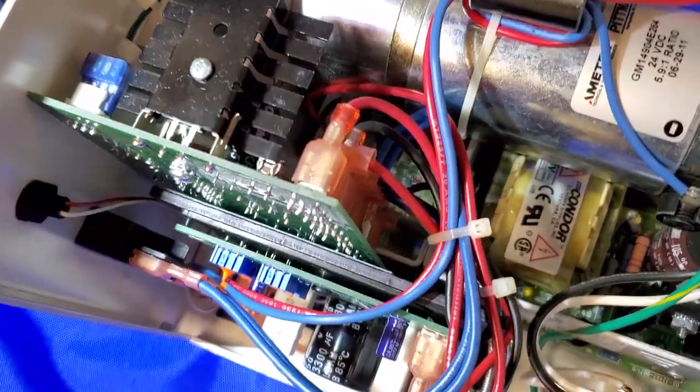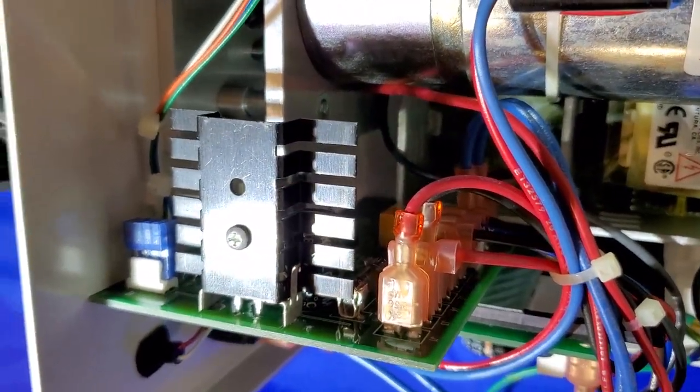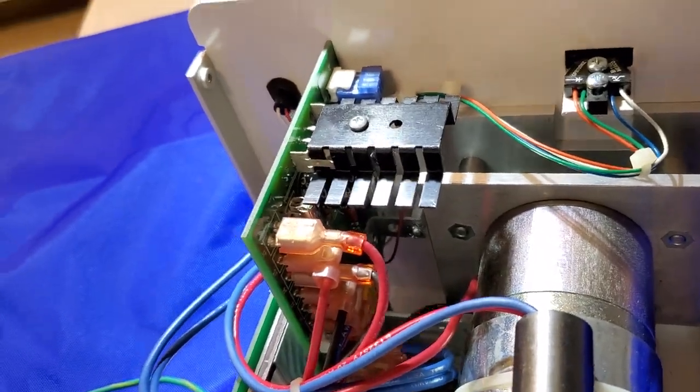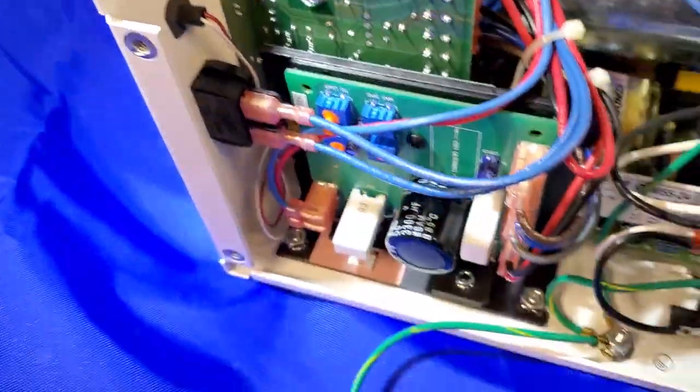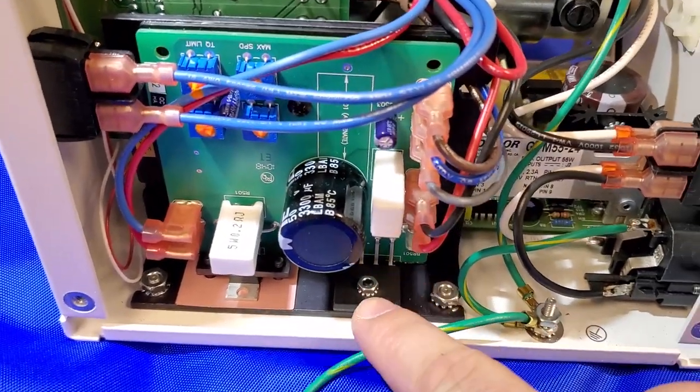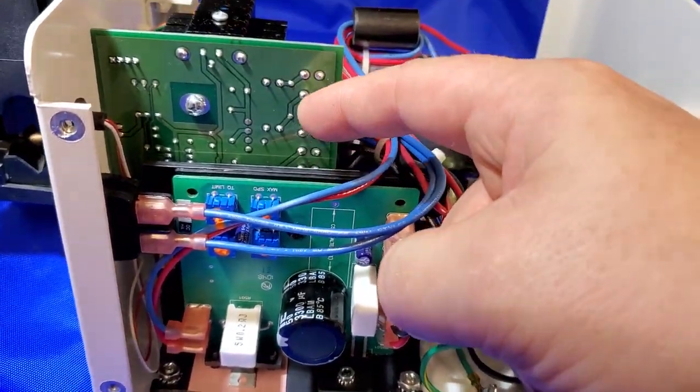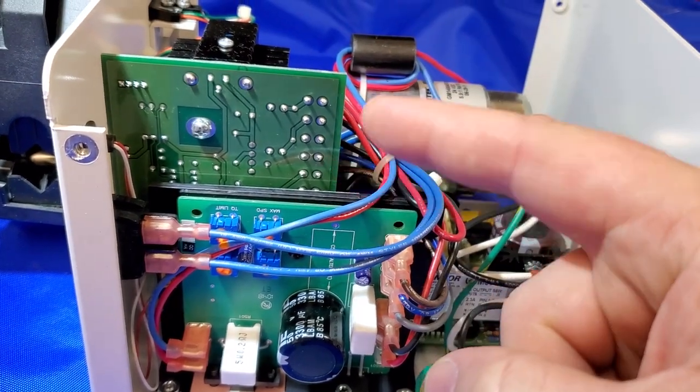And this card will turn on and off with the controller card, which is that guy right there. So the AC comes in, gets converted to DC. You can see a little bit of it goes back over to your controller card to power it and to control the switching.